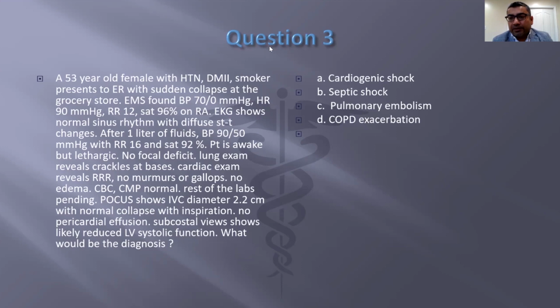Start with a view of the right ventricle and right atrium, and then change your view and your probe towards the liver to figure out where you are exactly in the anatomy. If you go straight to the IVC, you may not get it. So start with the apical subcostal, and then you move towards the IVC. We also have a couple of infographics on our website, so if you would like to check those out for the best tips and tricks, I would highly suggest that as well.